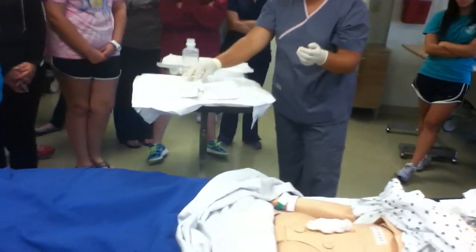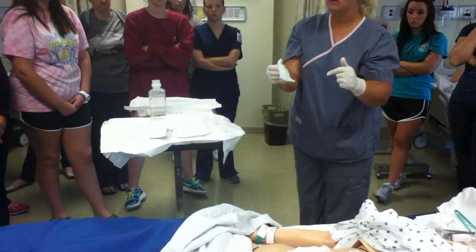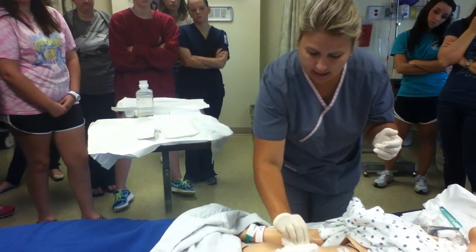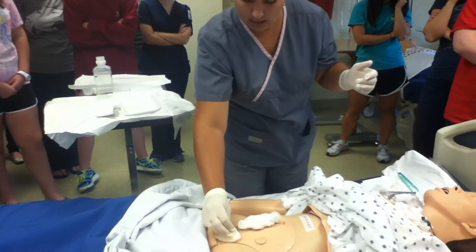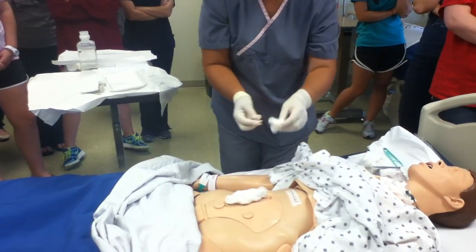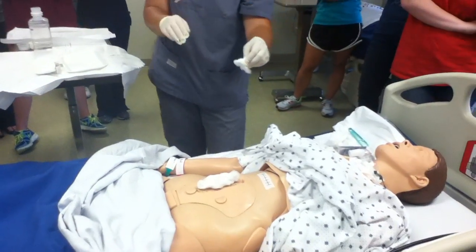The next thing I need to do is I need to lightly dry the skin surrounding the peri-wound area, the skin around the wound. So I'm going to take and I'm going to pat the surrounding areas. If I had more 4x4s, I would actually get rid of this and I would get me another one. And I would probably throw this one away and then get me another 2 so I'm not crossing over the sterile wound. See how I kind of work my way around?